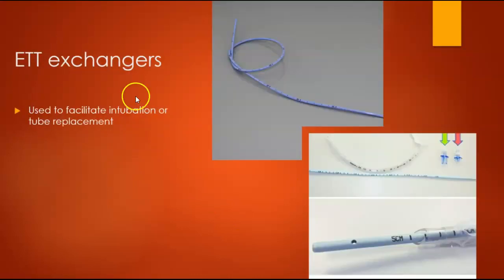Okay. ET tube exchangers. These are devices that we use in the critical care areas anytime we feel like our ET tube has become compromised and we need to remove it and put another one in. What's nice about these is they act kind of like a stylet. They go down the inside of the endotracheal tube, and we're going to play with these in lab. These go down inside the endotracheal tube, come out the bottom. I can then pull the ET tube off and leave this exchanger down in the airway.